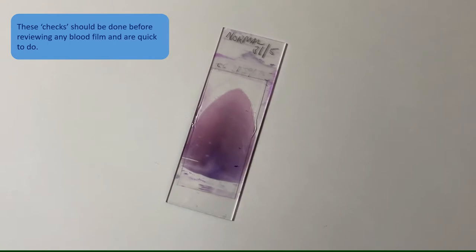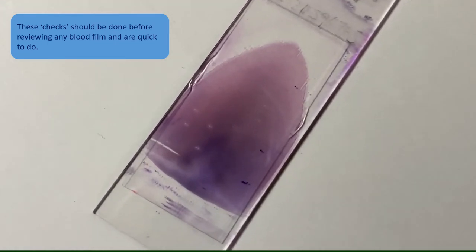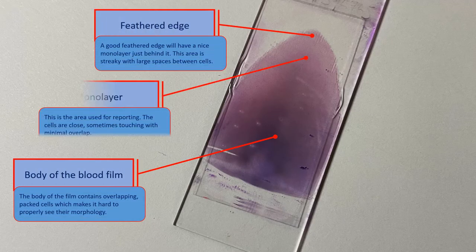When a blood film has been made and stained, it is important to check the quality to ensure it is good enough to report. The blood film can be divided into three main parts: the body, the feathered edge, and the monolayer.